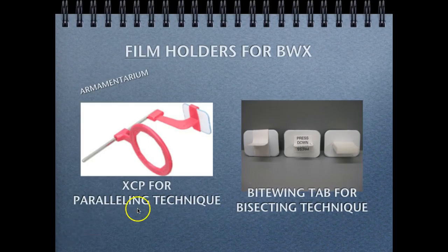They have some similar holders for film. So this is another type of paralleling technique device, an XCP. You have a rod and a bite block and a ring. And then also for film, you could have a BITEWING tab, either a loop that you place over the film or an adhesive type tab, or this is a little sponge with adhesive. And so this would also utilize that bisecting technique.